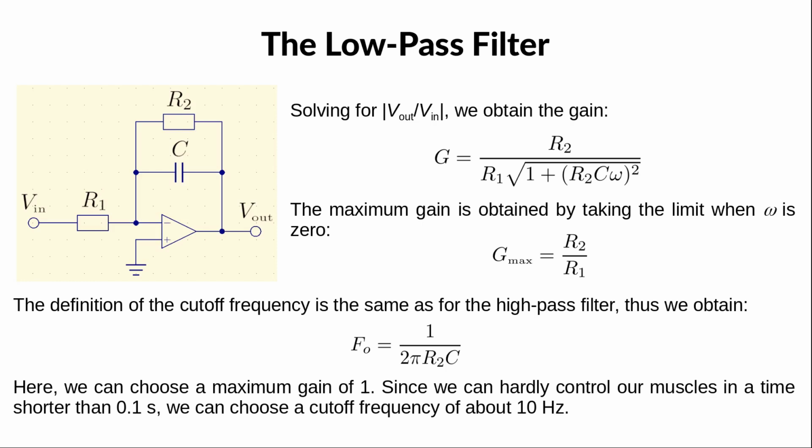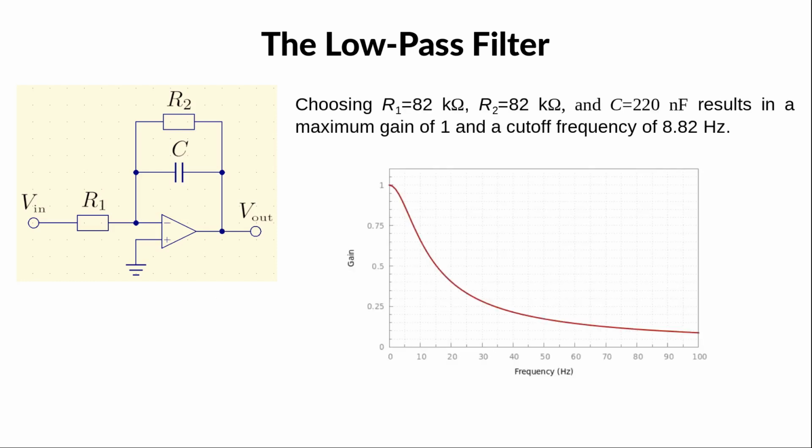As for the high-pass filter, I'll let you check that the cutoff linear frequency F0 is given by 1 over 2 pi R2C. Here, we can arbitrarily choose a maximum gain of 1, and since we can hardly control our muscles in a time shorter than 0.1 second, we can choose a cutoff frequency of about 10 Hz. A possible choice for the component values is R1 equals R2 equals 82 kiloohms and C equals 220 nanofarad. These result in a maximum gain of 1 and a cutoff frequency of about 9 Hz.